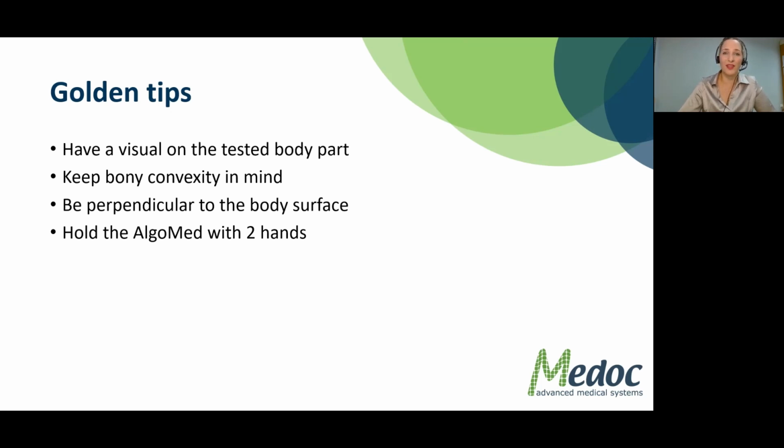By the way, there has been an interesting study where they used the AlgoMed to test skin flap techniques on the donor side, and to see whether the healing of a specific skin surgical technique was better than another surgical technique. So in this case, they did want to look at scar tissue. Another thing that can happen is that your subject went to the beach yesterday and got a sunburn. You're not seeing this because they have a shirt on, but if they remove their shirt, you can see that the skin is sunburned.